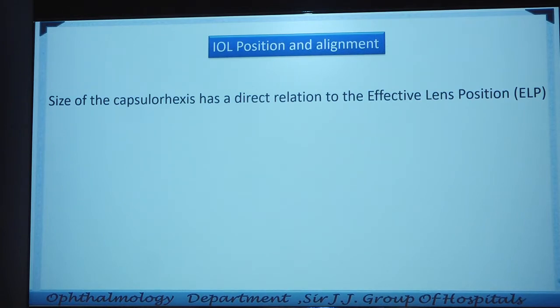Why? On the second day the patient is going to ask you, I don't have vision. Why are we not taking care of the others? He is not going to ask you, oh, I can see. Finger counting at 5 meters, the patient is happy. 6 by 6, the patient is unhappy. And you are taking care of that 6 by 6, and you are not taking care of this finger counting. Please take care of that.